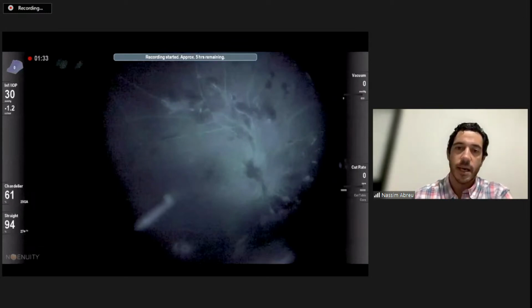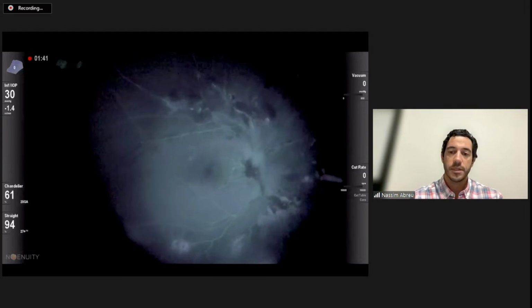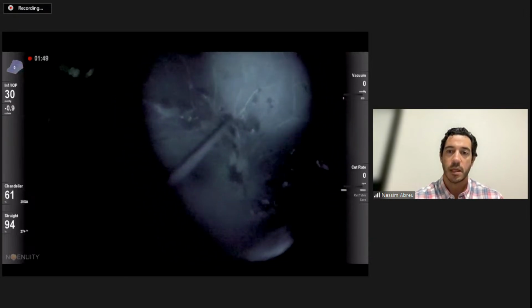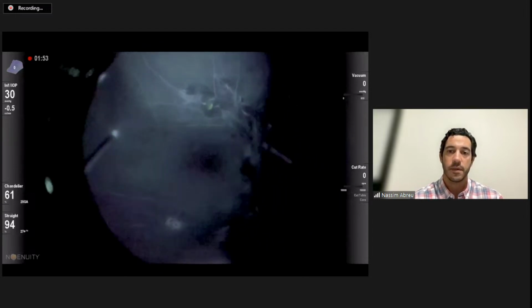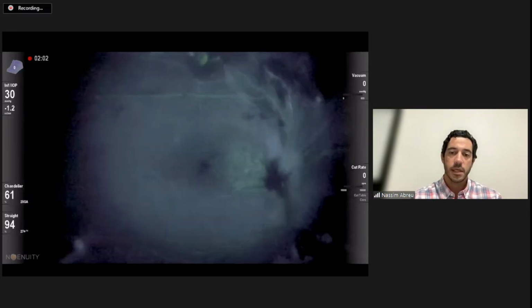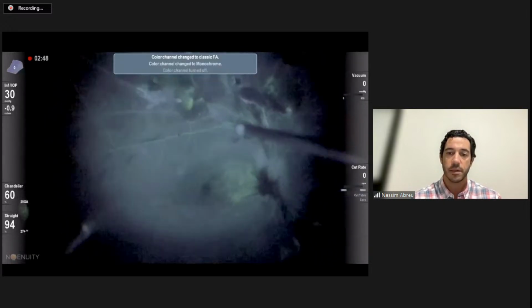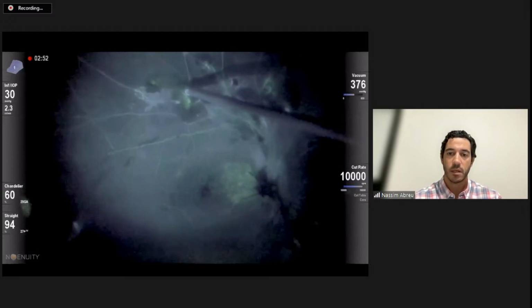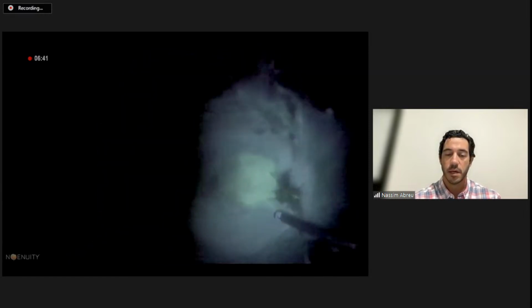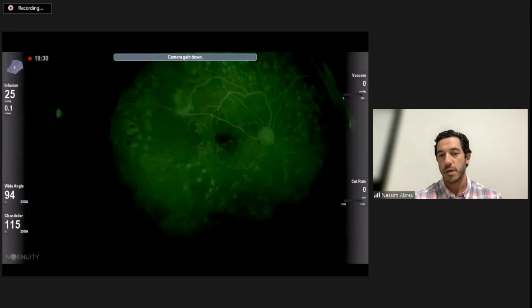So I have a couple of cases that we've done. Like I said, I haven't optimized my black and white digital filter. I like this gray and green filter because it gives me a lot more light to the video. I don't have to manipulate the video editing. And here we can see that this diabetic patient has a lot of non-vascularized peripheral parts of the retina. We can see a severe macular edema, mainly on the papillomacular bundle, and we can see active neovascular leakage here in the inferior temporal arcade. I think that in diabetics, it's probably the main pathology that we can think of, that we can use it here.